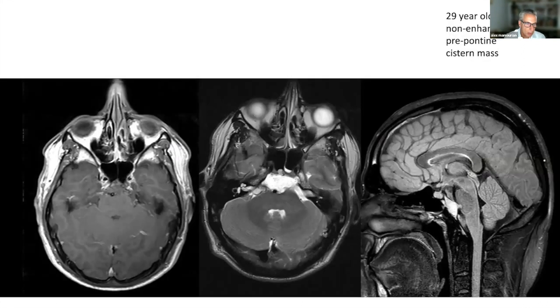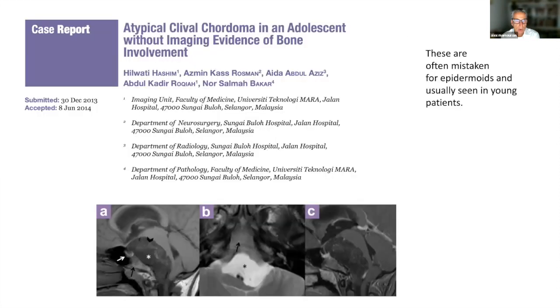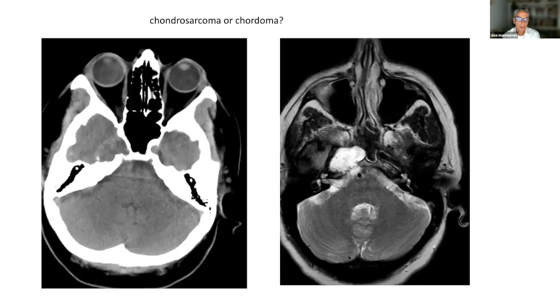This is a different patient with a pre-pontine mass — high signal intensity on the T2-weighted scan, non-enhancing — which also proved to be a chordoma. And here is a chordoma without any clival involvement but with some enhancement. So to summarize: whenever you see a bony destructive lesion in the midline with T2 prolongation and enhancement, lead with chordoma. The other consideration when it is off-midline with T2 prolongation is chondrosarcoma.